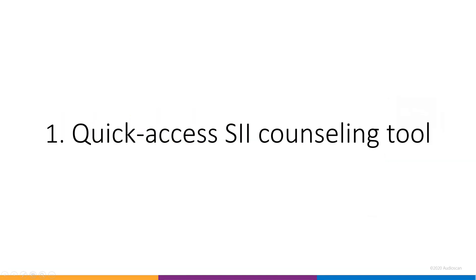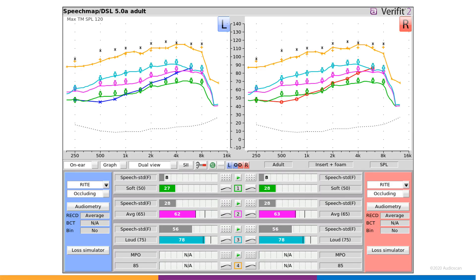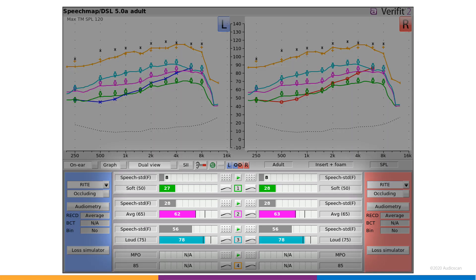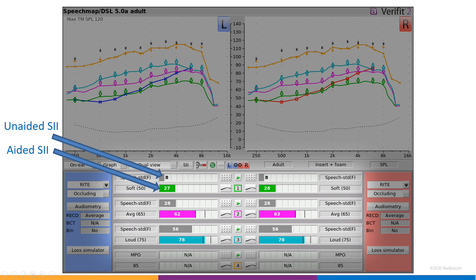The Quick Access SII Counseling Tool. SII, or Speech Intelligibility Index, scores are always displayed along with any SpeechMap speech test. These figures are shown here in the Audubars and are displayed for both the aided test and the predicted unaided condition. SII is calculated based on the ANSI S3.5 1997 standard.